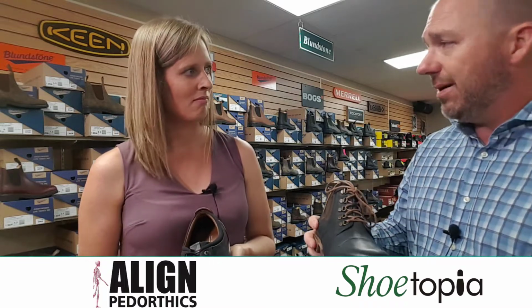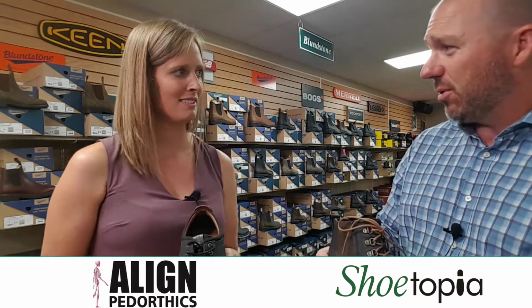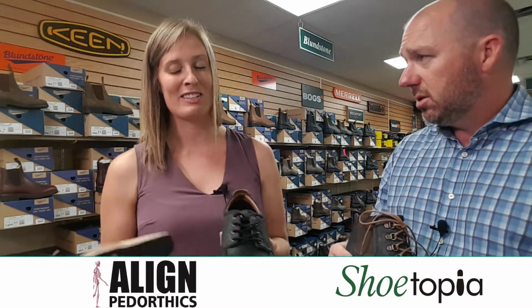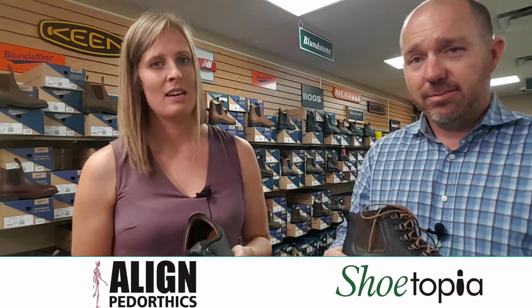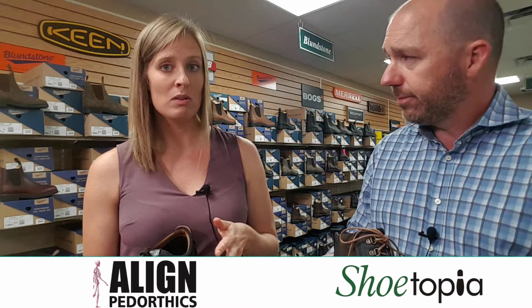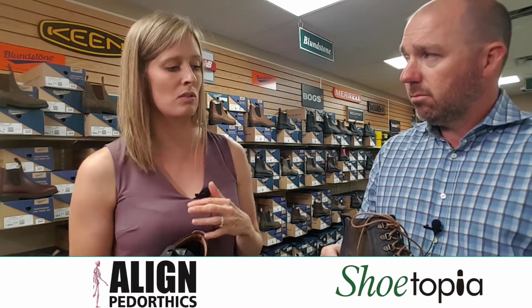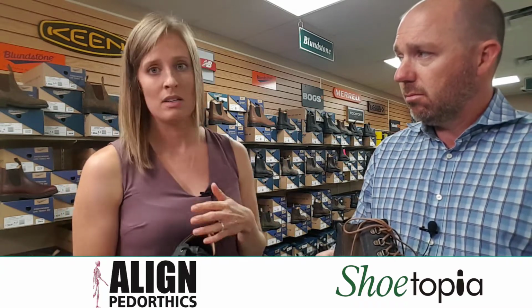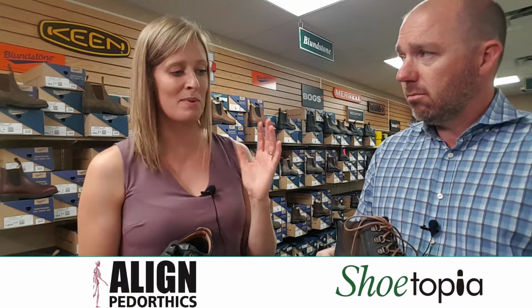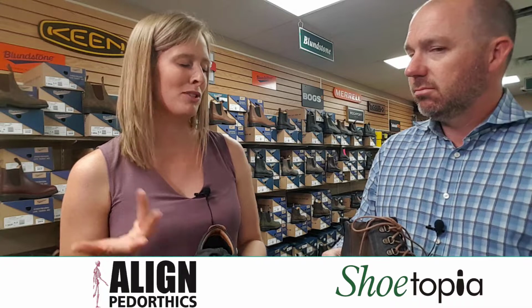Sure. So if I'm new to orthotics, what else might I expect, now that we know a little bit about the different orthotic pieces? So there's going to be a break-in period with your orthotics. That's something that I tell all of my patients. About 2 to 3 weeks after you get the orthotics is the time that you want to take to slowly break them in. So whether that means just wearing them for 2 hours to start and then slowly building on time, that's totally fine. Some people can throw them in and away they go. That's awesome if you're that person, but for the most part, people do have to take it slow.